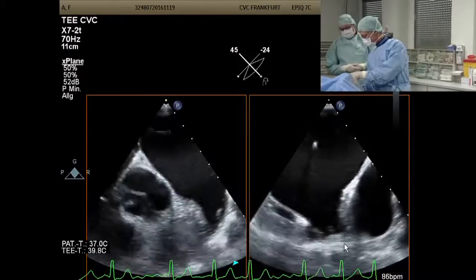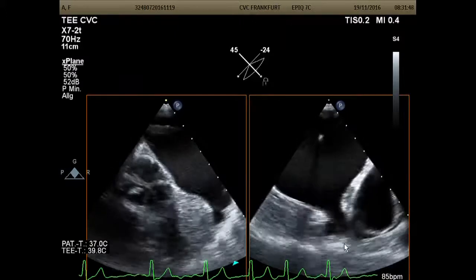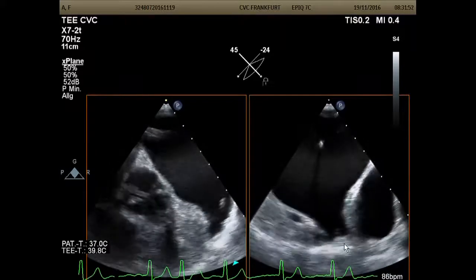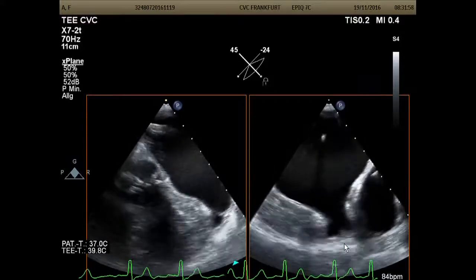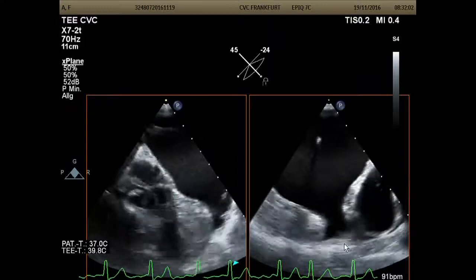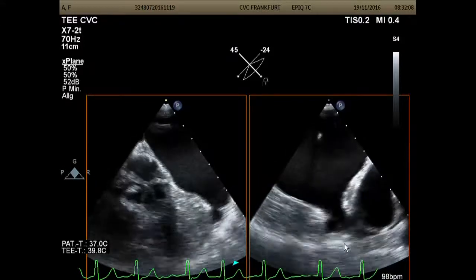The trick that we have learned is to be a bit diagonal with the sheath, with whatever device you're going to put. So I think there's enough depth for the width. Using what size and type of device? Watchman. If I'm doing Watchman, with 23 you're going to be maybe somewhere between 27 and 30, and you have to be able to find a place where you could put a 30.